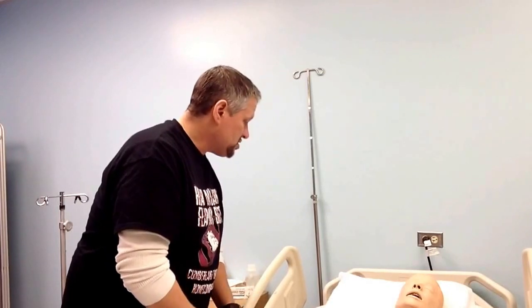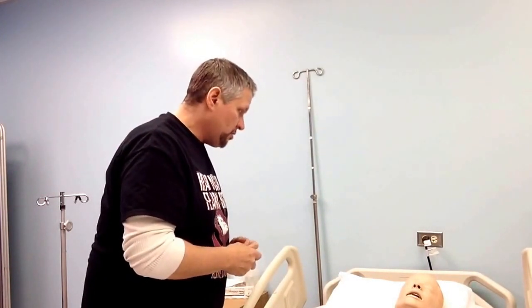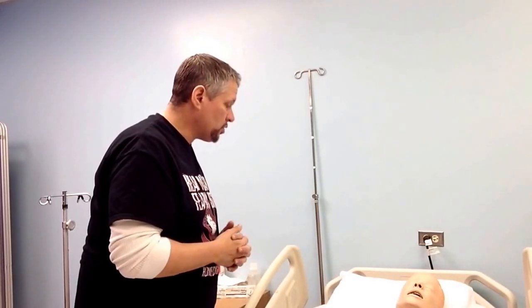Great. Mr. Pierce, today we're going to do an enema. Have you ever had an enema before? What the enema is going to do is help clean out the bowel impaction that you have in your stomach. It's going to help give you a bowel movement so you're not feeling so bloated.